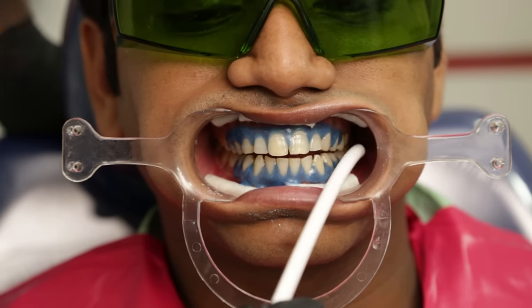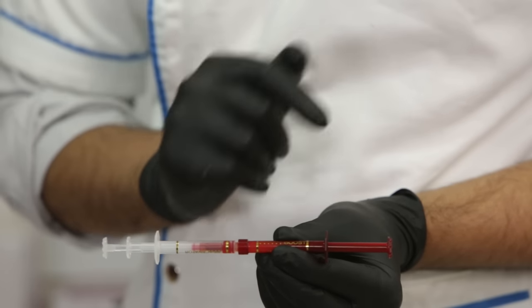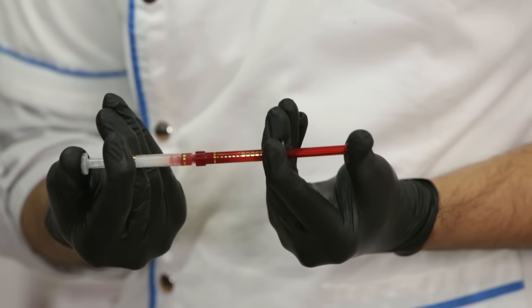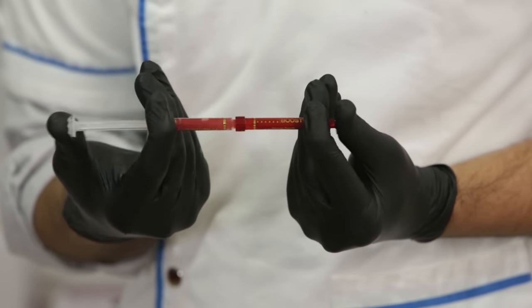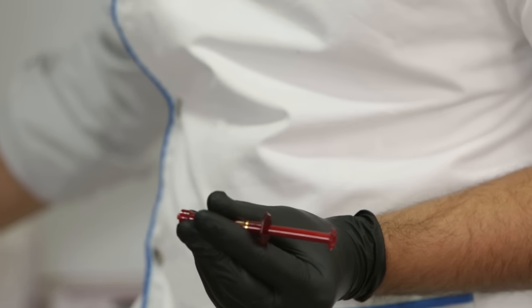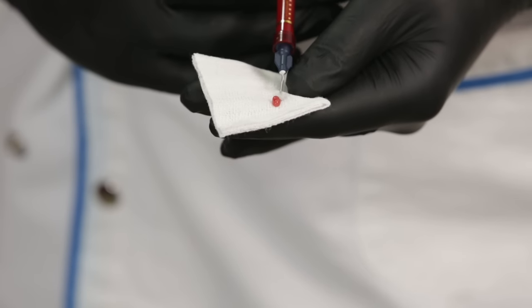We are now ready to apply the bleach. Because it is chemically activated, we need to start mixing it just prior to the application. This is how the two plungers get attached to one another. We push the clear plunger to rupture the membrane inside and then push the red plunger to transfer its contents into the clear syringe — this combines the bleach with the activator. We continue pushing on the two plungers alternately to ensure proper mixing, and this process should be repeated a total of around 25 to 30 times. The gel should be contained in the red syringe before it is separated from the clear syringe. We can then attach the delivery tip onto the red syringe and verify even flow without any resistance on a piece of gauze.